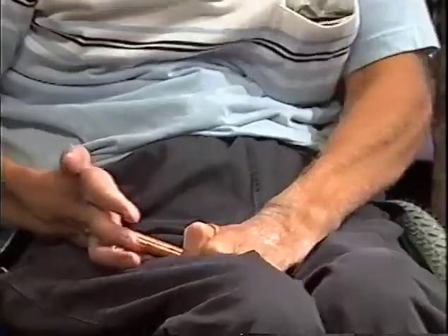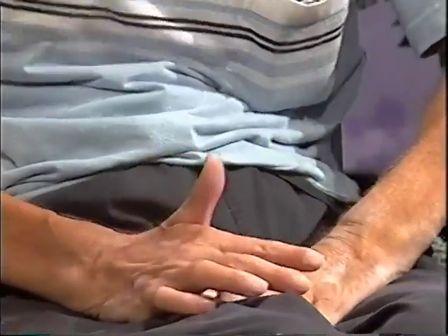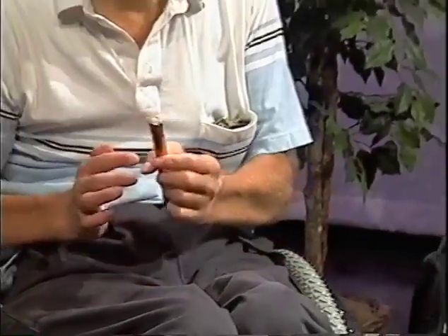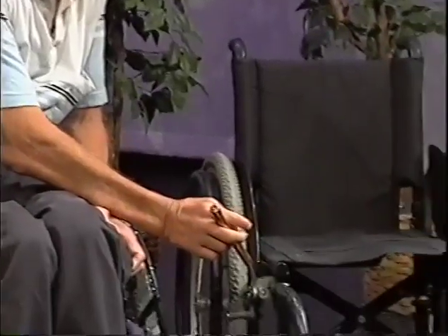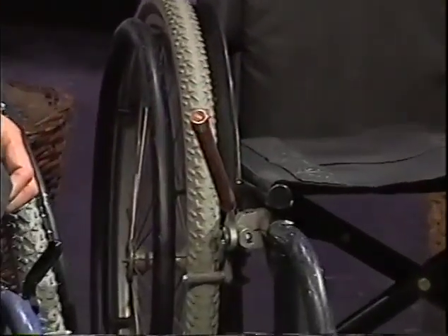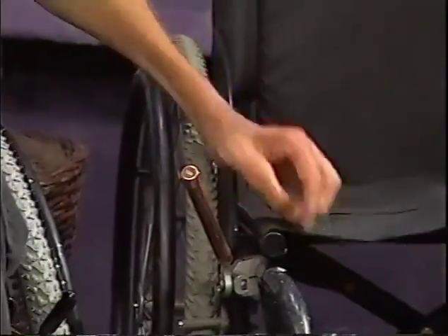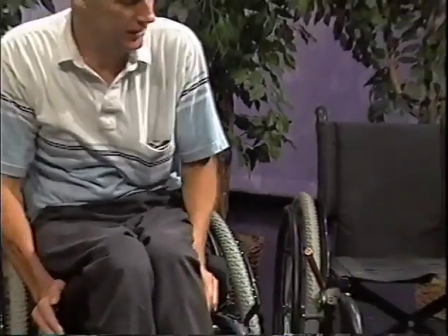Get a 6-inch piece, get a cap, and you can just stick that on there. That fits right on so the patient won't hurt their hands. And this can be slipped right over the brake extension. And now you have a perfectly functional brake extension and a cheap fix for a common problem of losing your brake extensions.